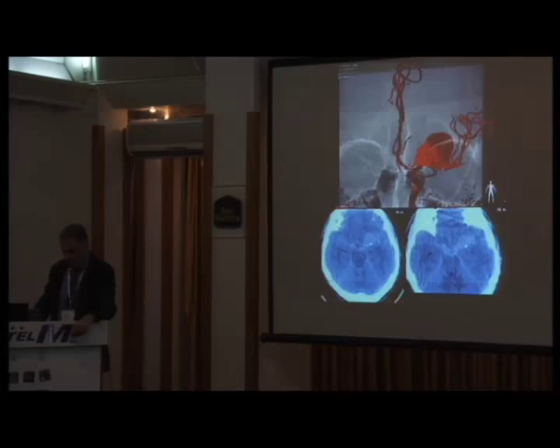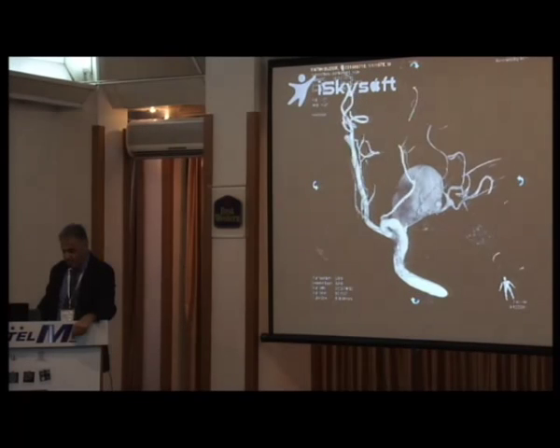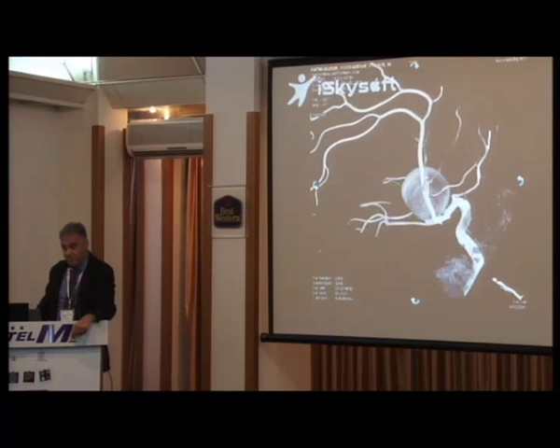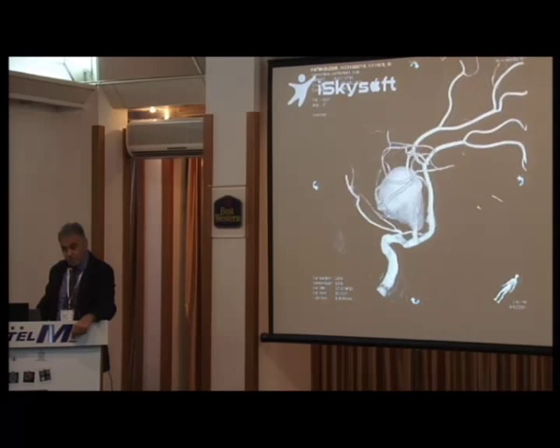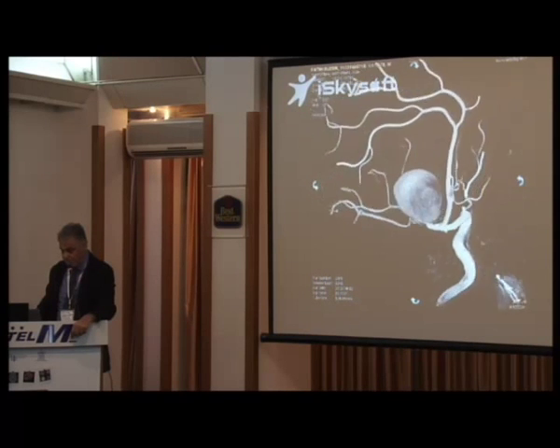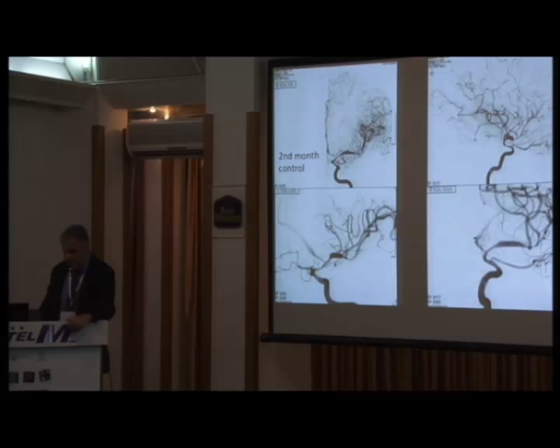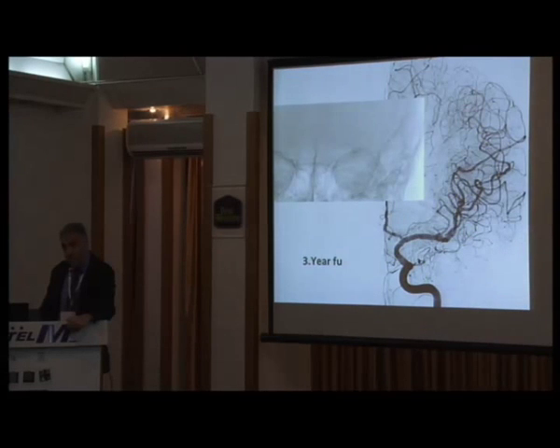And this is after. But from time to time, you cannot occlude the aneurysm. This ruptured MCA fusiform dissecting aneurysm, how can you coil it? Because of the lenticulostriate artery. And no surgeon wants to do it. The only option for surgery is the bypass and occluding the M1 orifice. That's it. And we decided to do a dual scaffolding technique with Leo and Silk. Look at immediately after how dramatic the change in the aneurysm, and the second month follow-up. And this is the 3rd year follow-up. He is still working in a factory, using his hands as a worker.